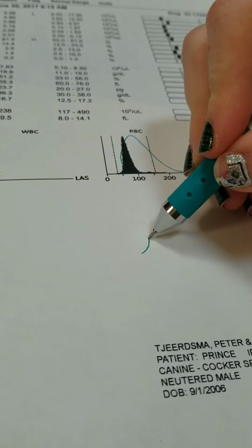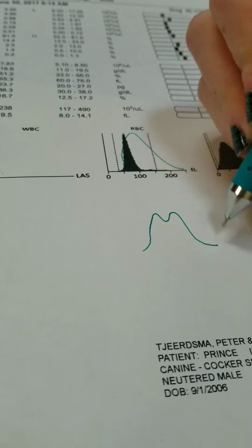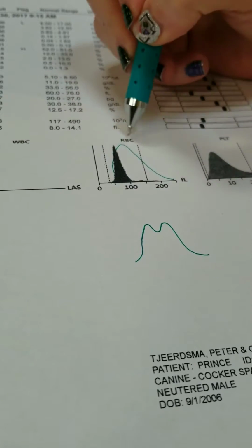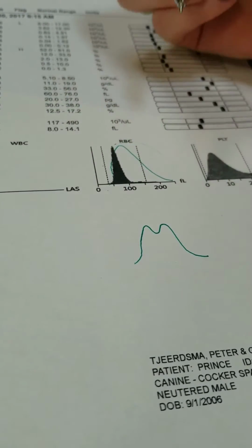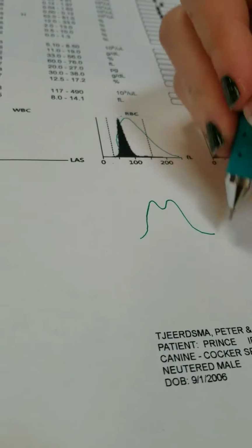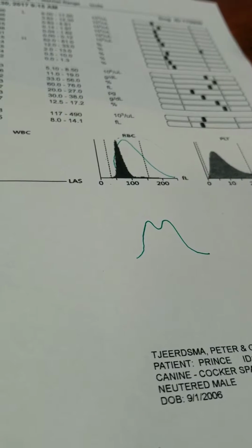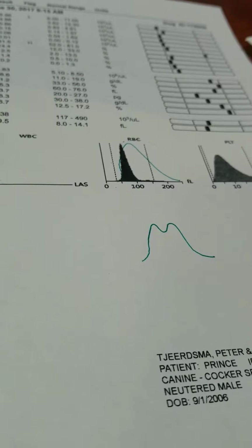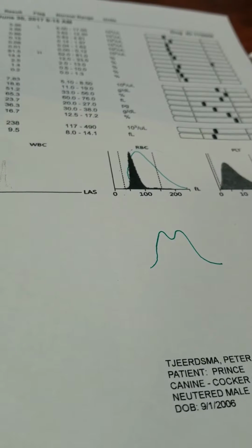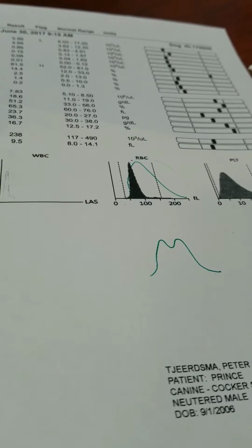If you have something that looks like this, you have two separate sizes, and part of that is very well going to be a separate population of nucleated reds. I wouldn't be surprised if this type with the wider band had some nucleated reds, because you do have that, just not as many as with a double peak. So nucleated reds are not going to get lumped in the white cells. They shouldn't. You may have the occasional patient that does because of just how massive the cells are, but by and large, it is able to pick them out and keep them in the red cell population.